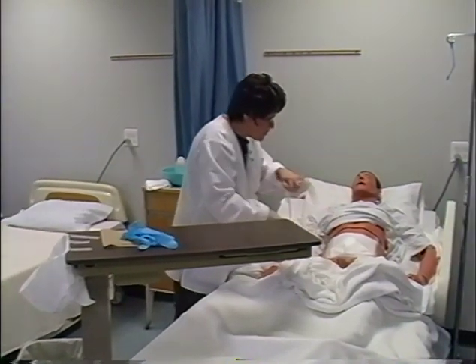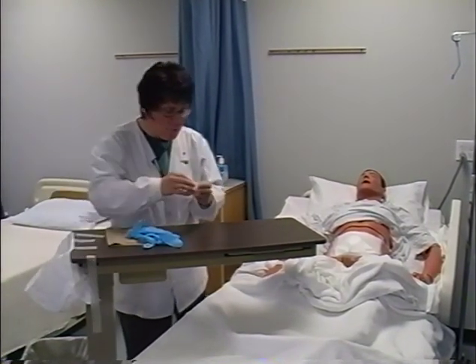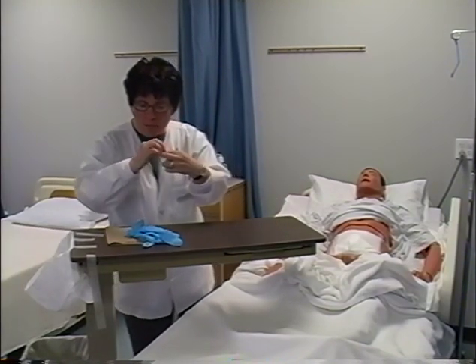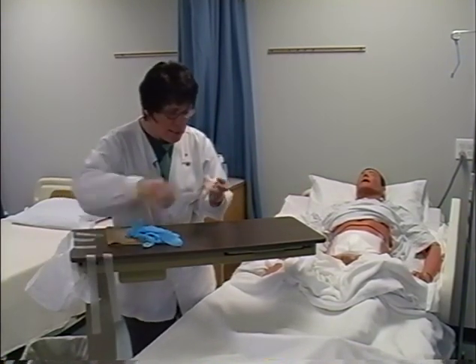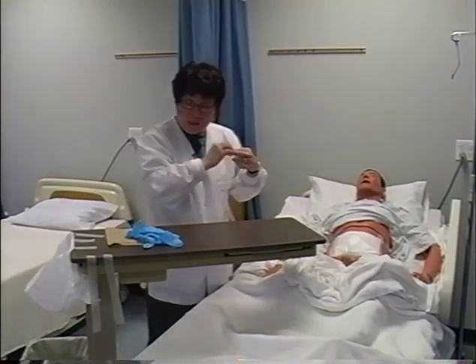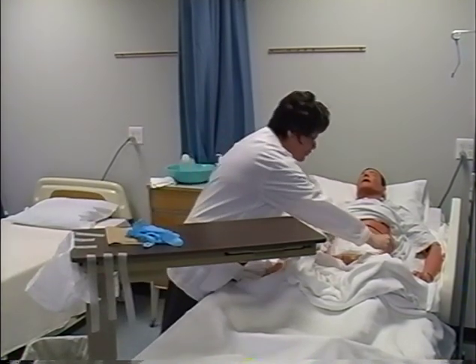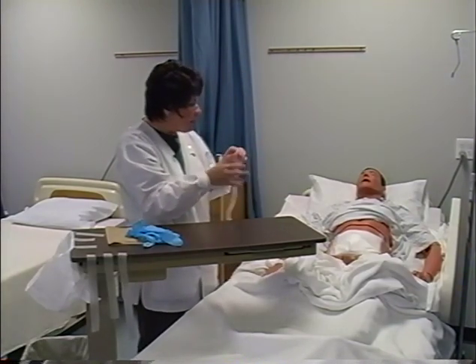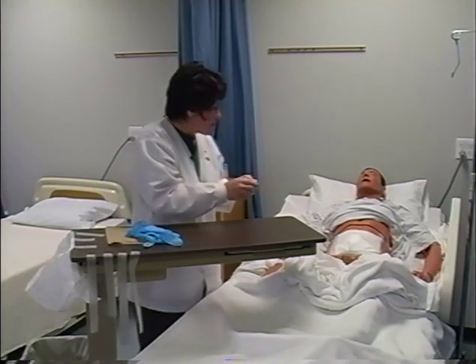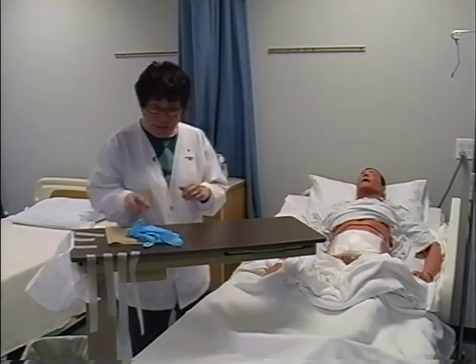I'm next going to measure the tape while Mrs. Lewis has her old dressing on, and I'm going to put my strips of tape on the back of my table so they won't get tangled up with any of my dressing supplies. I'm going to turn one end of my tape over about a quarter of an inch — it'll make it easier for the next nurse to change the dressing so he or she won't have to scrape tape off Mrs. Lewis' skin. I'm also checking the date and time on Mrs. Lewis' present dressing, and I can see it was last changed yesterday at 10:20 a.m. by Mrs. Cope.